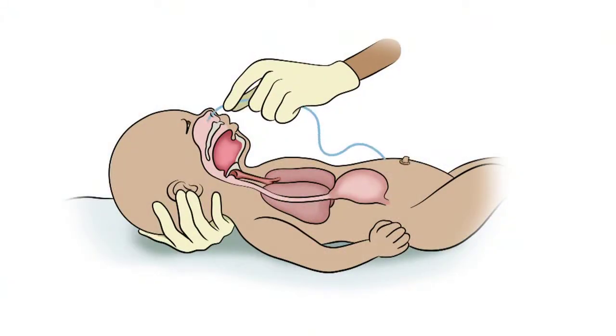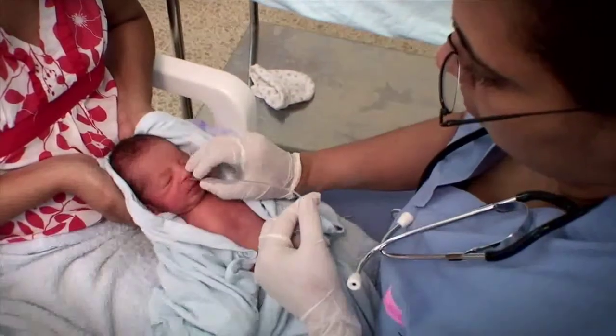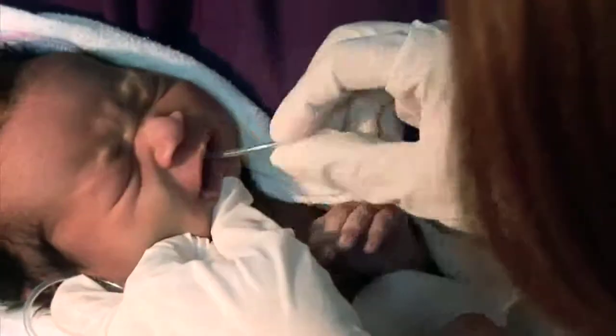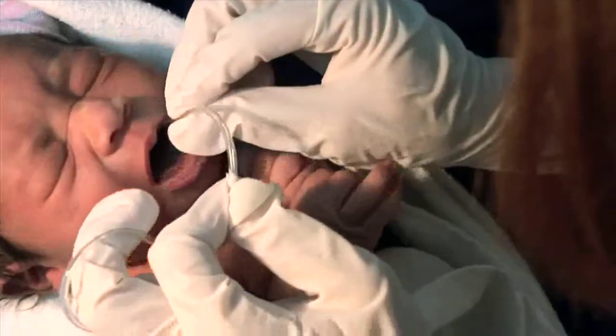The tube is passed through the nose or mouth, down the back of the throat, and into the stomach. Put it in a nostril if the baby is breathing easily. Put it in the mouth if he has breathing problems, if the stomach needs to be drained, or if you don't have a very narrow tube.